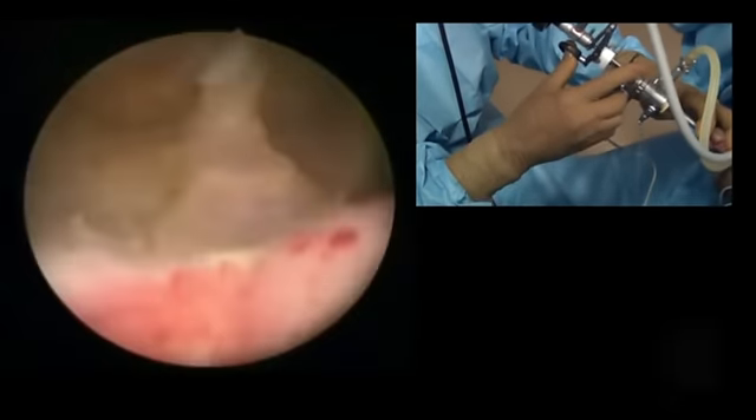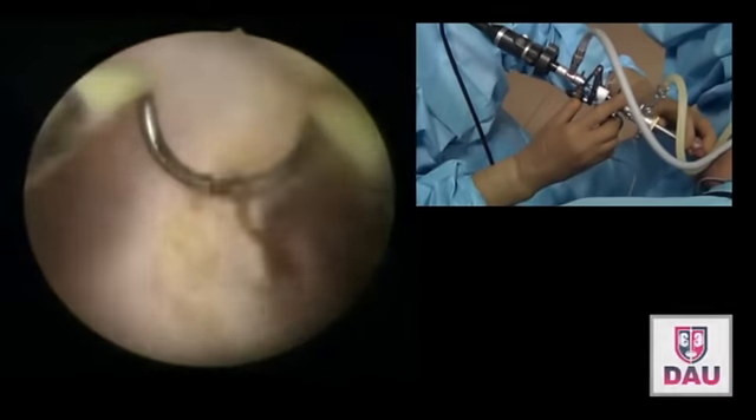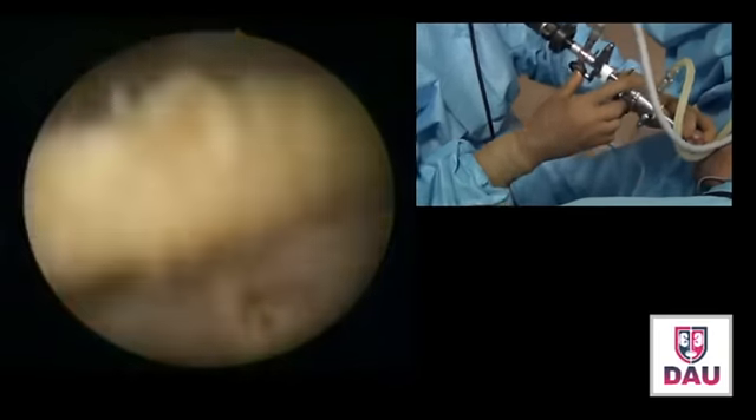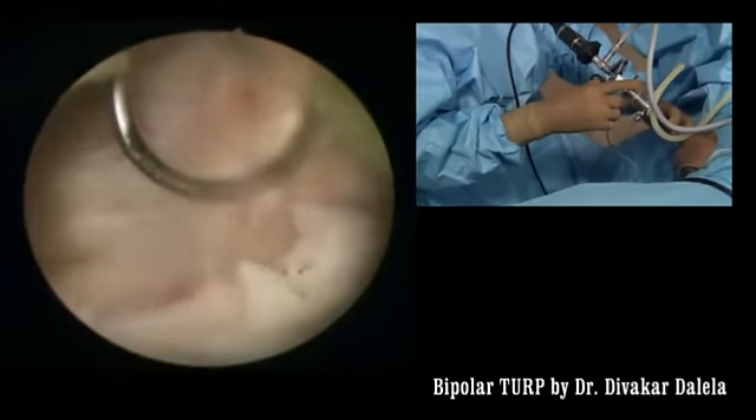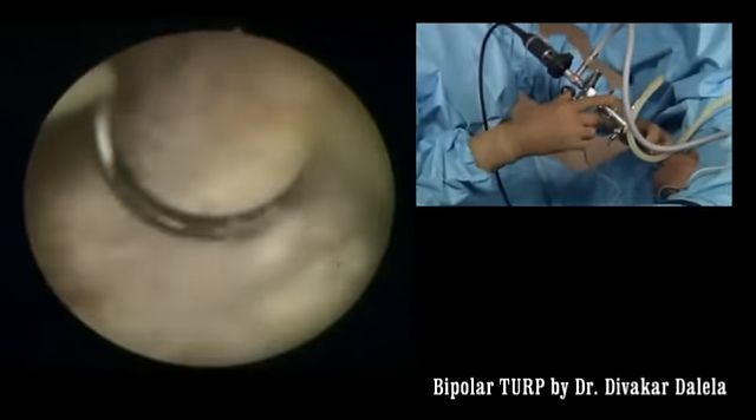There is some small tissue here — you may not do anything about it because there is a sinus here. The small bleeders there, just regulate them.